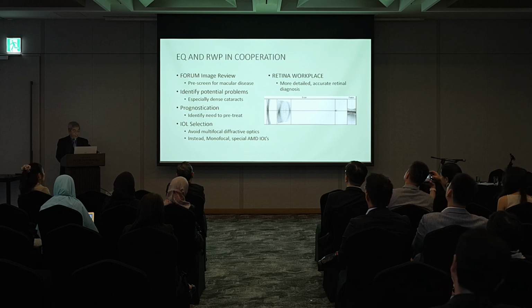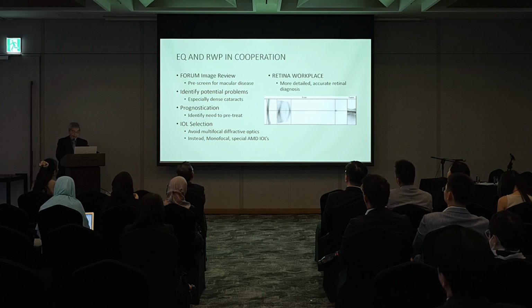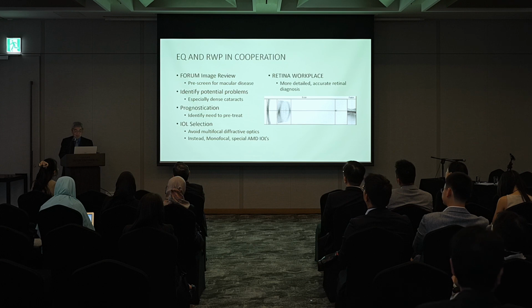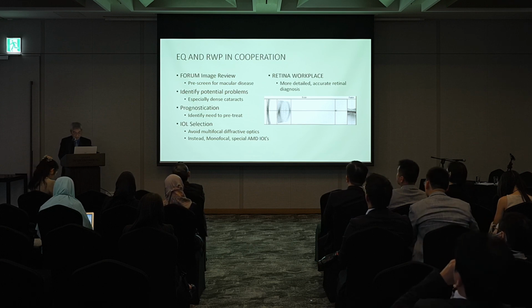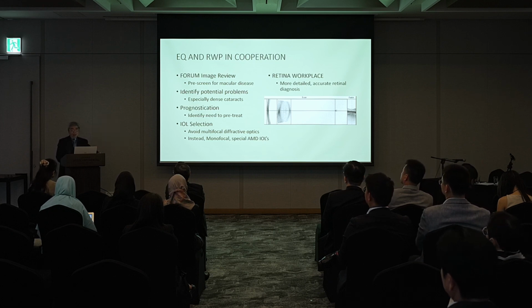But you can also access this EQ Workplace on the same computer that you can look at the Retina Workplace. And for patients who are undergoing cataract surgery, what we like about the IOLMaster is that it gives you this mini swept-source OCT image of the fovea. And we always make sure we look at this, especially in patients who are going to receive a premium IOL. We want to make sure that this is normal looking before you proceed. Or in some cases you can automatically include the OCT as part of your pre-operative workup. Maybe we can ask our experts here what you do.